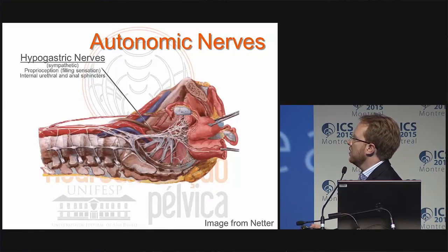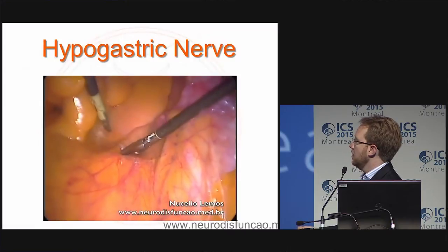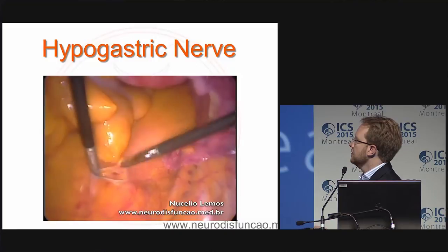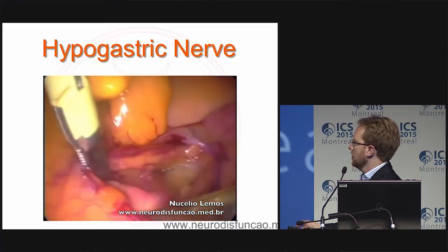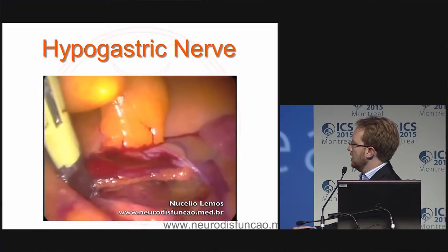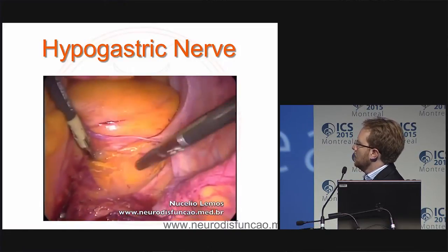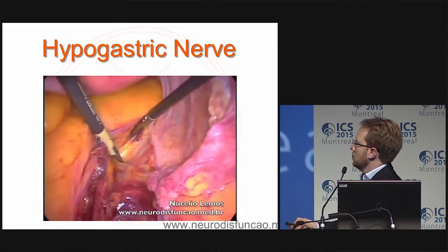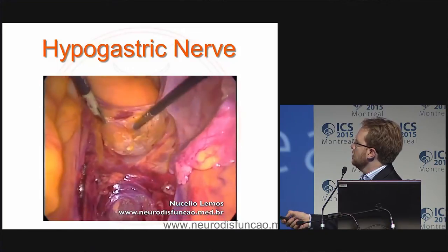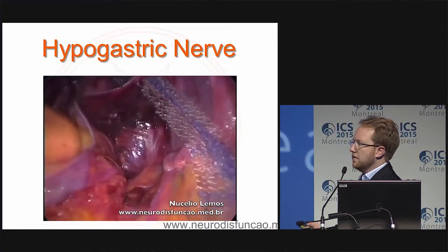The hypogastric nerves in women are often confused with the uterosacral ligaments. Here we're opening the pre-sacral space to perform a sacral colpopexy, and I'm opening the pre-sacral fascia. When you dissect the pre-sacral fascia, you can find the hypogastric nerve on the right side running over the fascia, and you can see it spreading into three branches to the bladder, uterus, rectum, and the nerve to the lower third of the ureter.